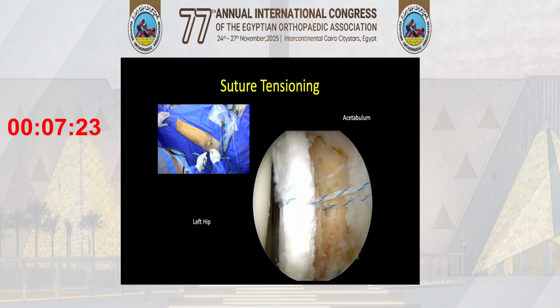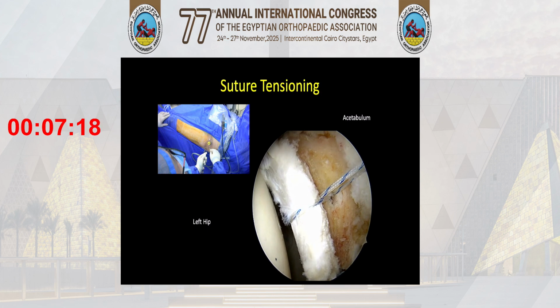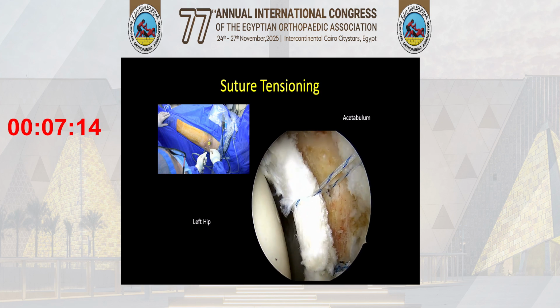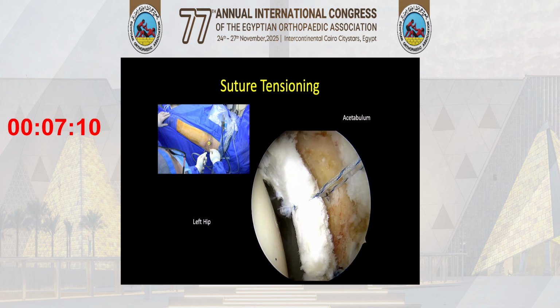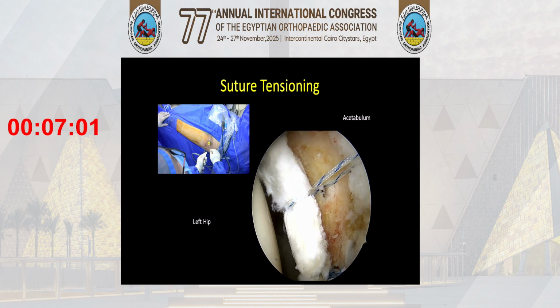After we pass the suture, you can see that we always do the lasso loop. I like to do that. It gives me tension. I'm able to control the eversion and inversion of the labrum, which is important. We always want to maintain inversion to maintain the labral seal at the end. So I always do the lasso loop so I can control exactly the position while I'm tying.